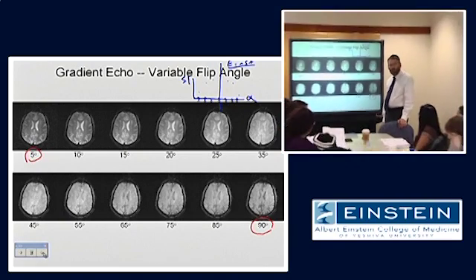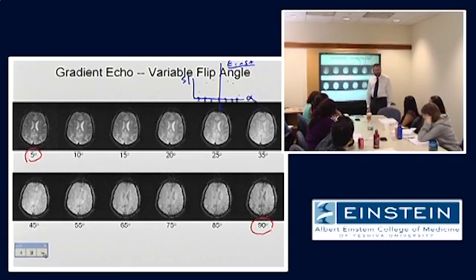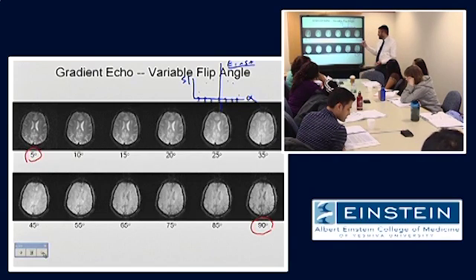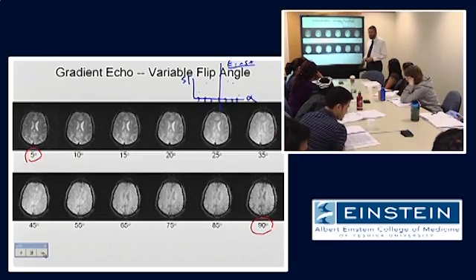Isn't the Ernst angle dependent on tissue? So couldn't you have two Ernst angles here? Absolutely. For different sections? Sure, depending on where you measure. And if you're measuring in two different places, you won't necessarily identify the same angle because it's a function of TR and T1. In all of these measurements, the TR is the same, but the T1, of course, varies based on tissue. Okay? I mean, I think you see that most obviously if you look at CSF, which has a much longer T1.